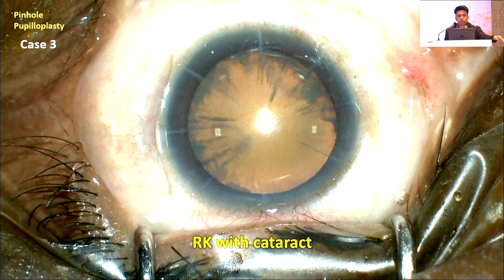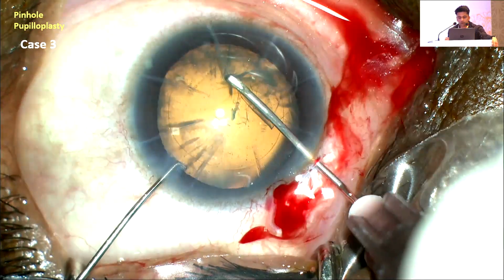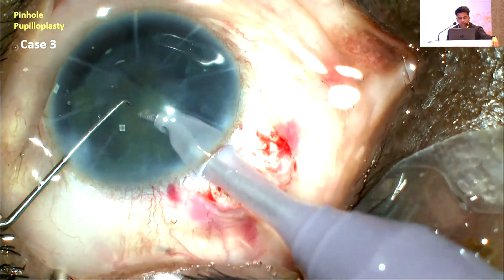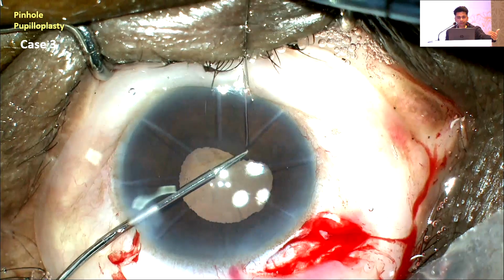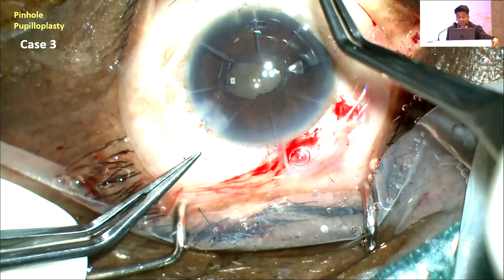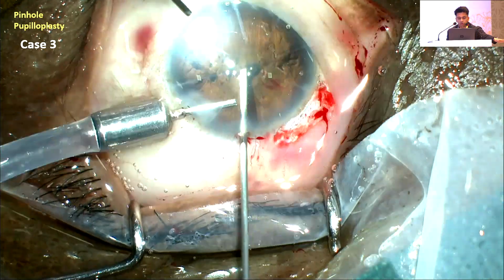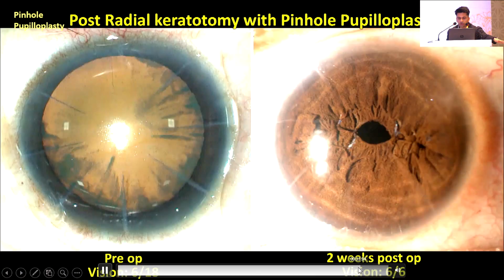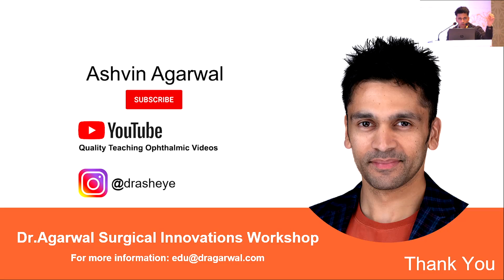I know a lot of questions will be asked on that, and I'll come to the most obvious question. This is a post-RK patient. Obviously, I've removed the conjunctiva so that we can avoid any incision expansion because of the RK wound. In these cases, again, these are terrible corneas because you have very irregular astigmatism. The easiest solution we've seen in these cases is to do a pinhole pupilloplasty, and it removes the issue. Just in the interest of time, I'm going to show you this: 2 weeks post-op for the same patient, and this is the fundus image after the pupilloplasty. That's what I wanted to tell you.